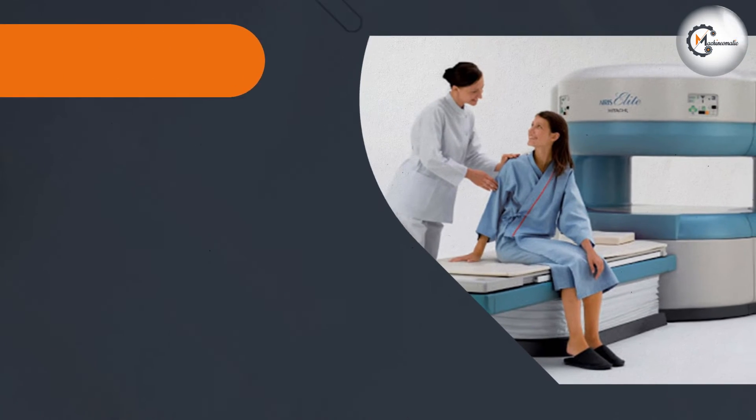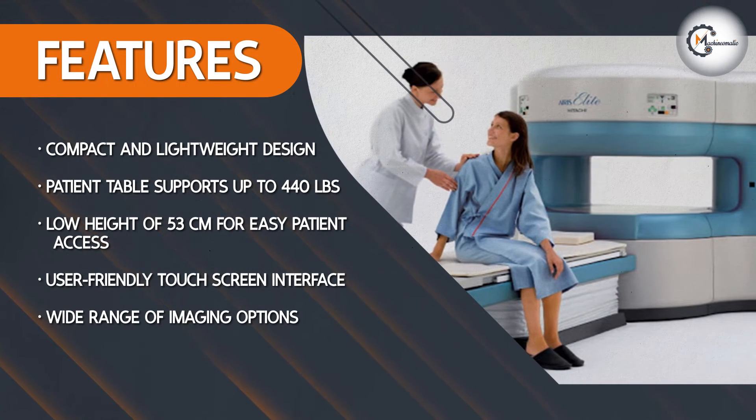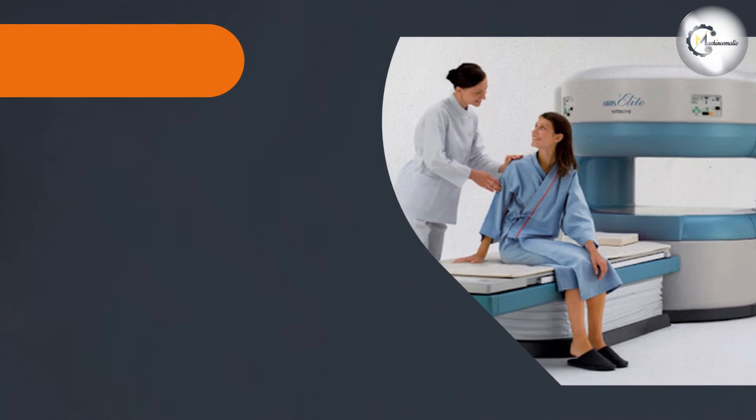The machine is equipped with a patient table that can support up to 440 pounds and has a low height of only 53 cm, making it easy for patients to get on and off.